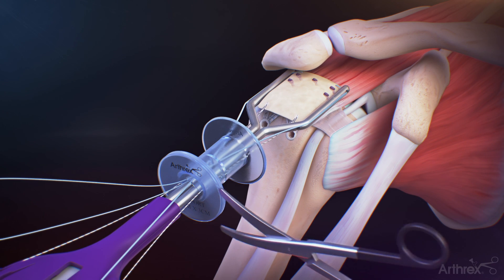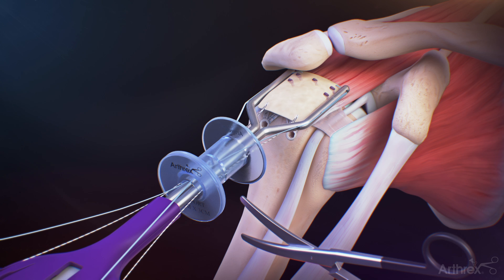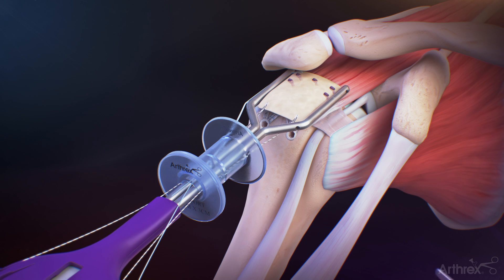Uncleat and cut one end of the medial graft retention sutures before pulling on the opposite limbs for removal. This step must be performed with the graft spreader in place to provide counterpressure during medial suture removal.